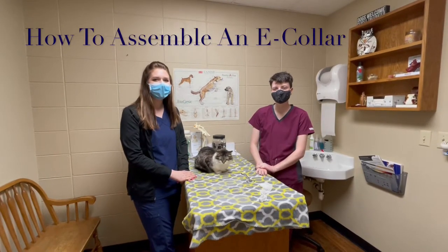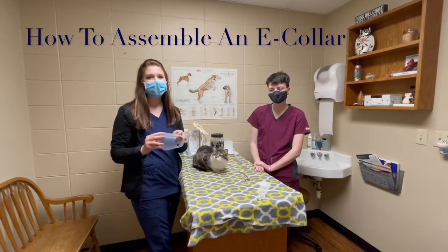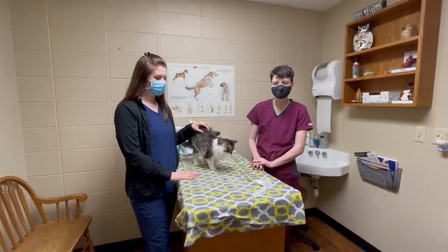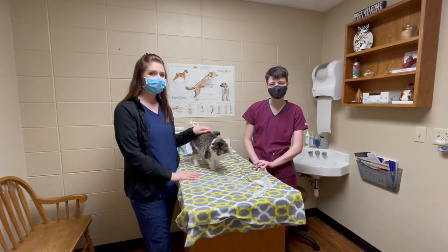Hi, I'm Whitney and I'm Marissa. Today we're going to talk about how to assemble a cone for your pet and also some care instructions with a cone. So if your pet has surgery, you might need to have them wear a cone for a while while they heal, just so they don't lick out all their sutures.